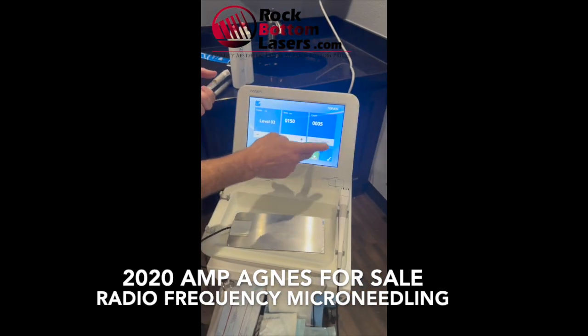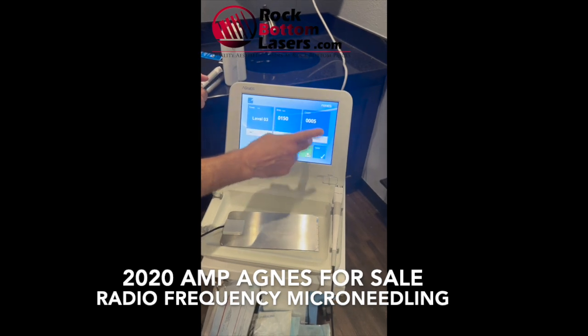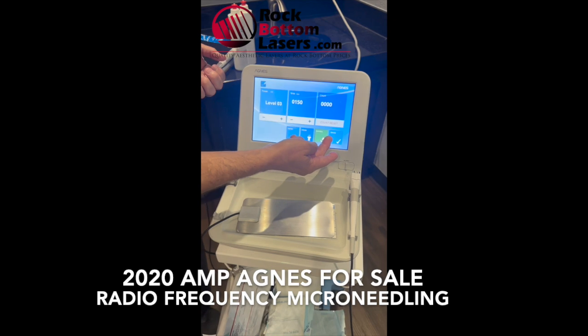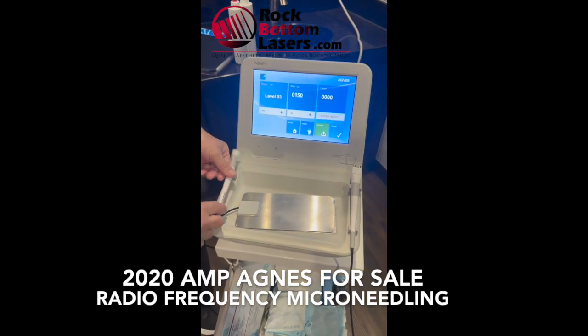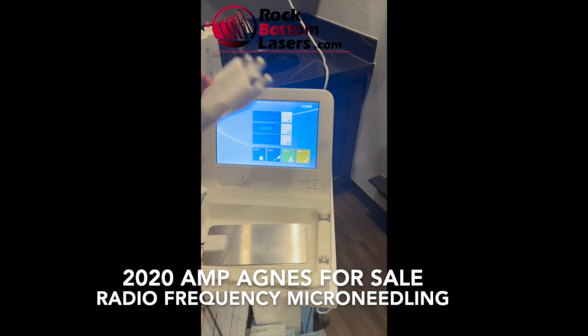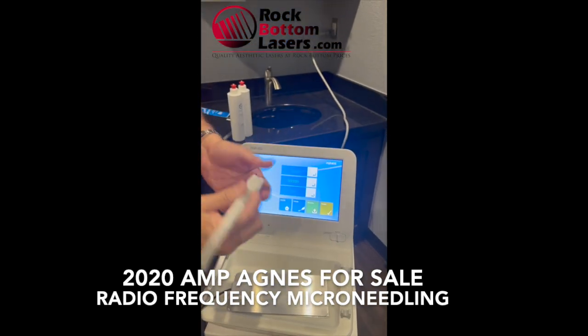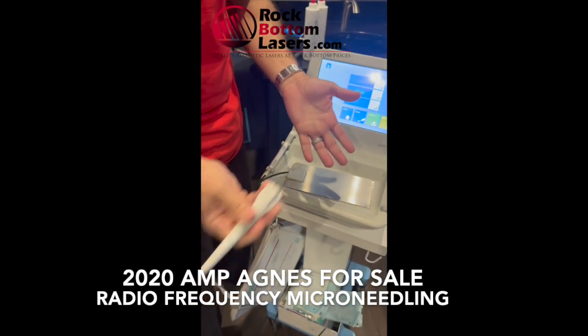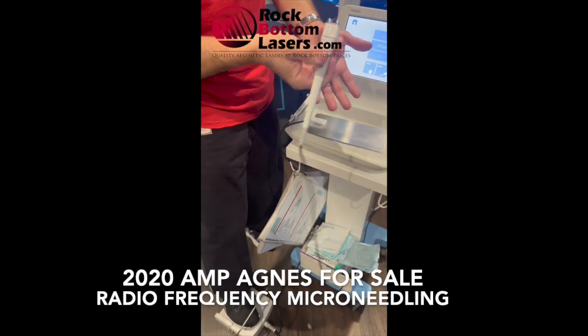For count reset: when you restart, you put it on standby, then count reset, and then you start on the other side. This is the mode for switching — this mode is for the radio frequency. Essentially, it's not going to heat up in time, but you press it, keep it pressed, and then you massage — that's the radio frequency.